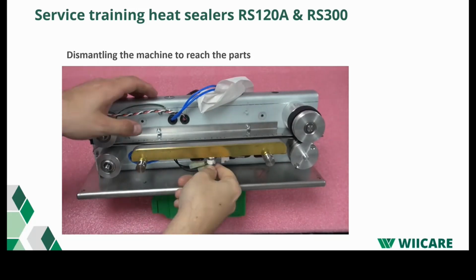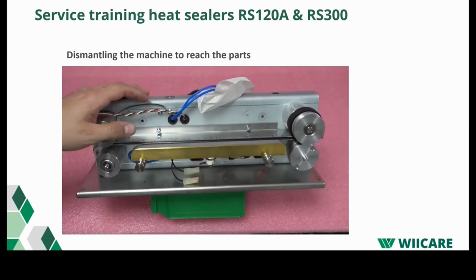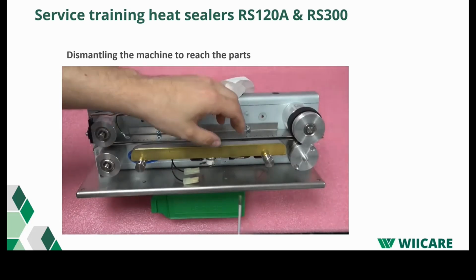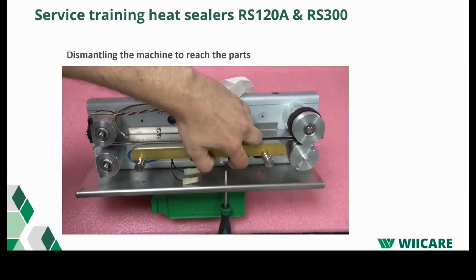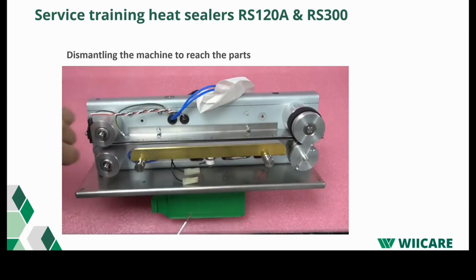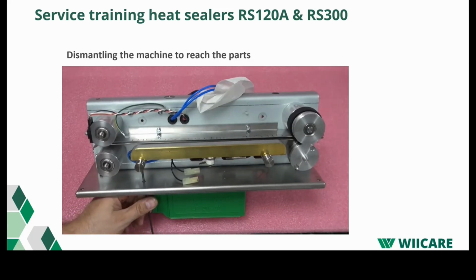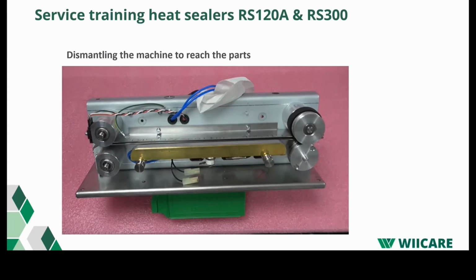Remove the cables from the Clixon. Unscrew the thermocouple. And unscrew the heating element. Now you can take out the heater and also put it in a paper towel.